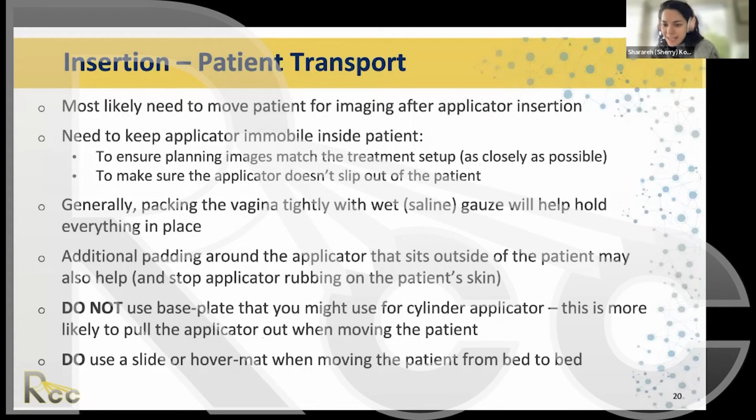And Holiday is asking, what would you advise after the CT to return to the treatment room? Anything you can think of, anything you can do to try and improve that immobilization. There are lots of different things you can do. One, packing is very easy and very cheap. We already mentioned this, and you can put a lot of packing in there, so it's held very tight inside the patient.